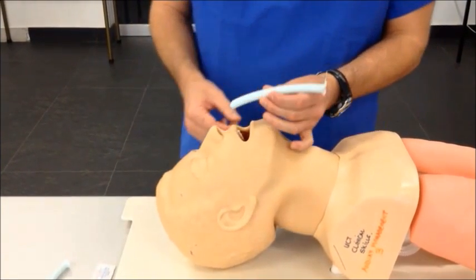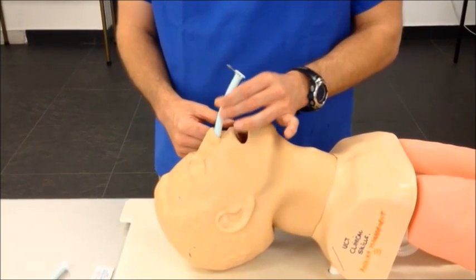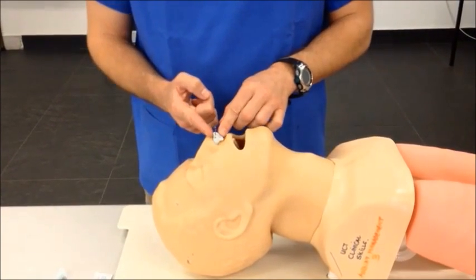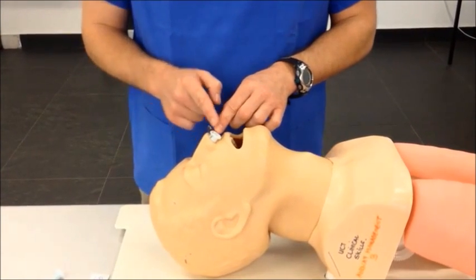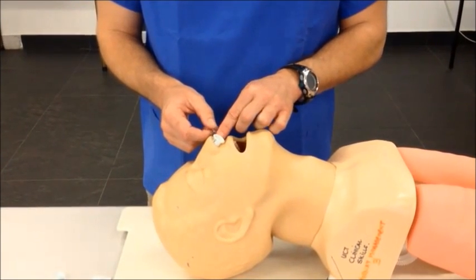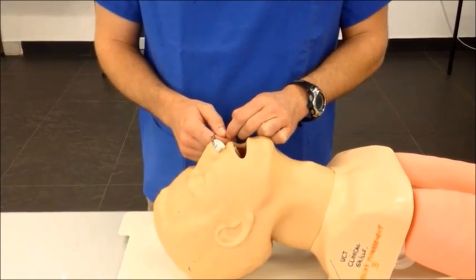Insert it into the nostril by initially angling it upwards and then towards the floor. With a gentle rotating or twisting motion, insert the airway into the nose. The flange of the airway should rest at the nostril. It's important to note that loss of airway or migration into the nasopharynx is a real concern and a possible complication, and inserting a safety pin or using an alternative device is a necessary safety precaution.